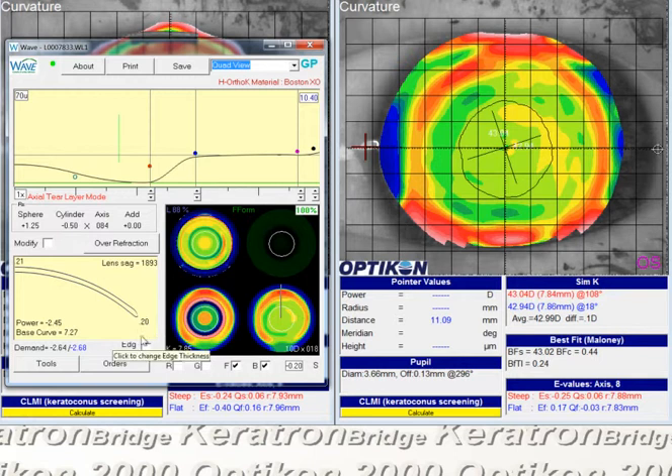We can hit the edge button — that'll help bring the edge down onto the cornea a little bit more uniformly, and then bring the edge thickness way down too.